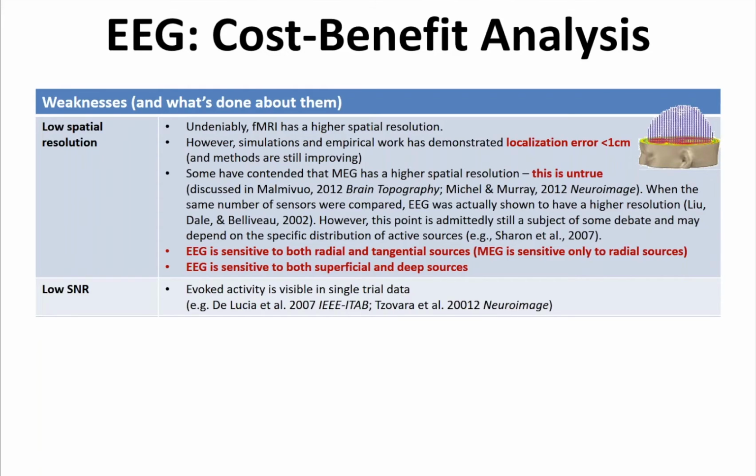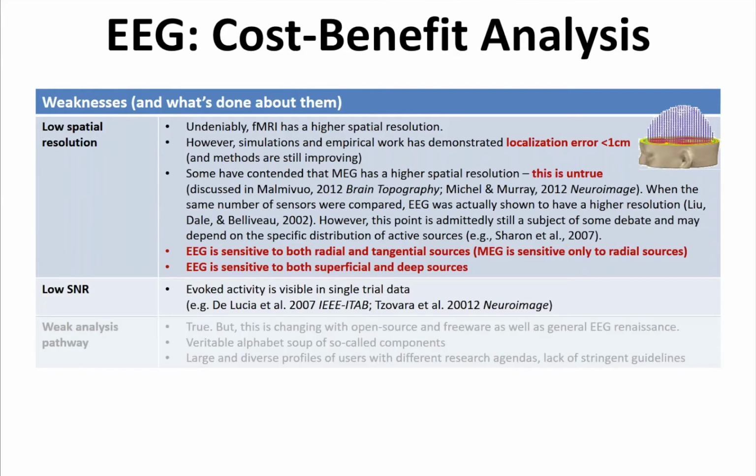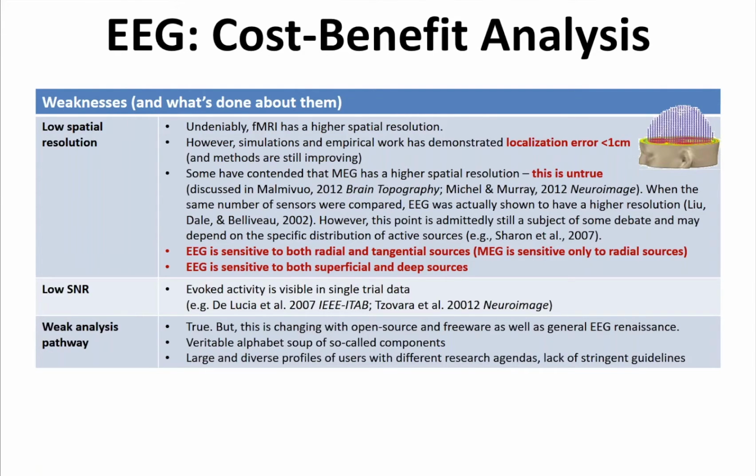Evoked activity is visible in single trial data. These are just two examples where we've specifically addressed this point. There's also some work by Charles Schroeder and his colleagues also looking at this not only in humans, but also in non-human primate models. There's also a remaining issue, in my opinion, about a weak analysis pathway.